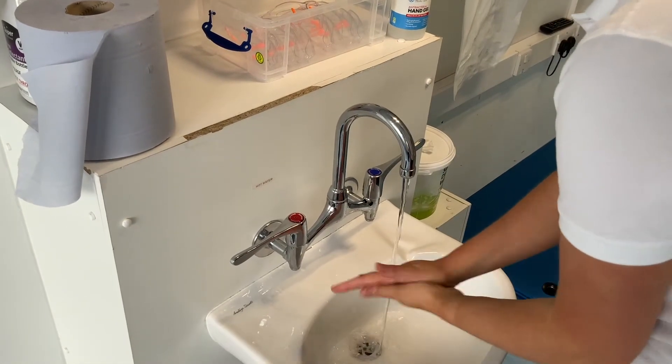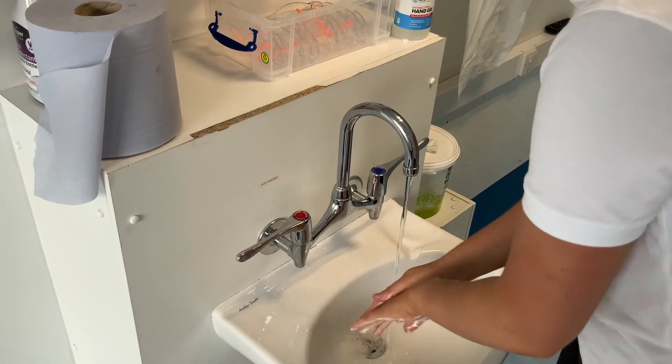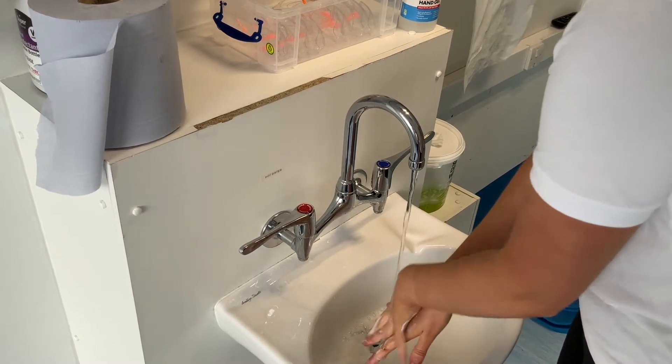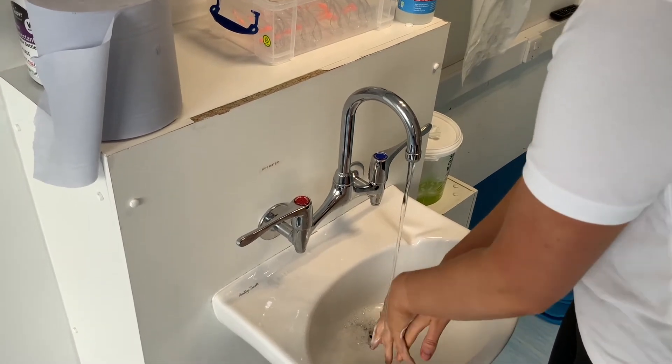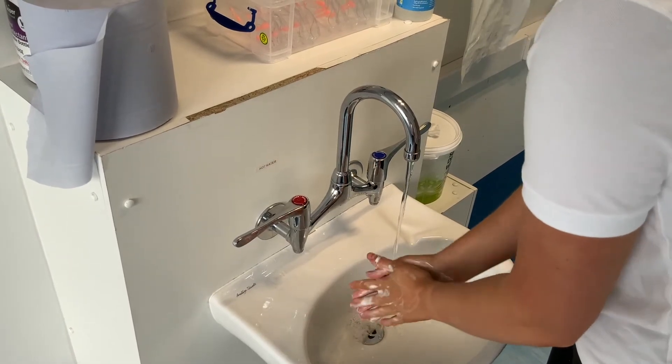I'm washing my hands following the NHS guidelines for infection control. Hand washing should take between 15 to 30 seconds. Then I am donning personal protective equipment such as a disposable apron, disposable gloves and goggles to protect myself and the patient.